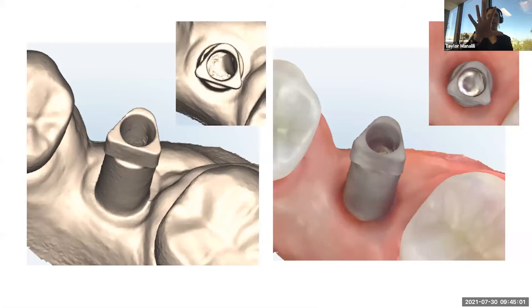So this is the kind of image that we're looking for, right? When we look down on the scan body, whatever geometry is on your scan body that you're using, you can clearly visualize it. You look at your scan, you look in the mouth, it looks the same. No distortion, no saliva bubbles, nothing on it. So same issues we get with conventional, we can get here too. It's just these are much easier solved than they are with conventional, right? Much quicker to solve these problems. So it's just recognizing them when they come about.